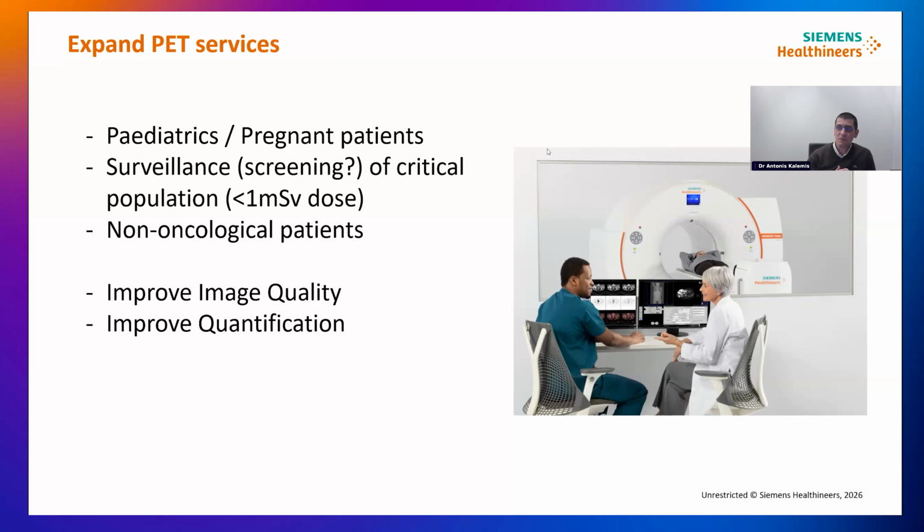This essentially has the potential, or actually has demonstrated, that it brings the PET of the old days, where PET was completely quantitative and was utilized for research purposes, now into the clinic, and being able to utilize these concepts that were identified 25, 30 years before, but now in real time in the clinic.